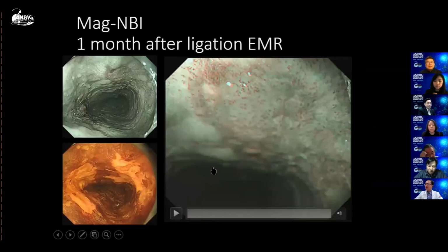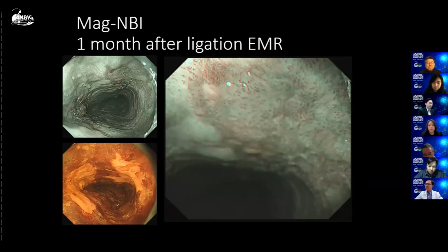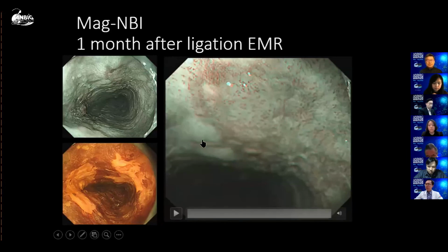So before treatment, before EMR, the elevated component may be the deepest area. It's a little bit difficult because the elevated area is an upward growth, so sometimes evaluations are very difficult. But in this case, I think the elevated area is the deepest. But my question to you is: is the deepest area corresponding to the previous EMR position?